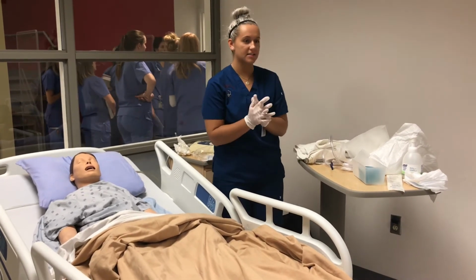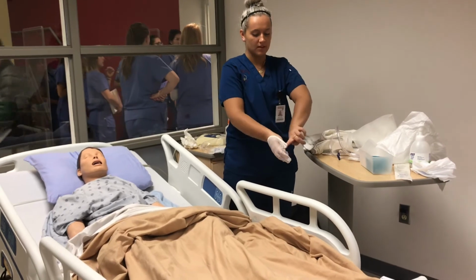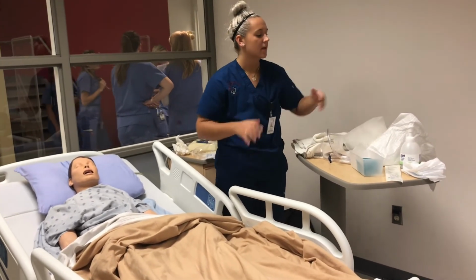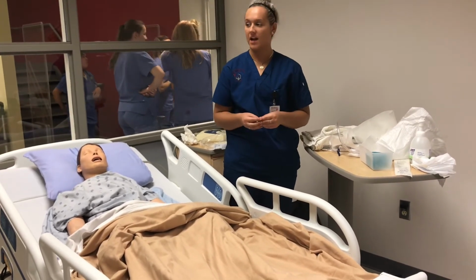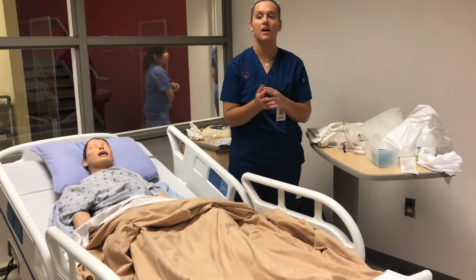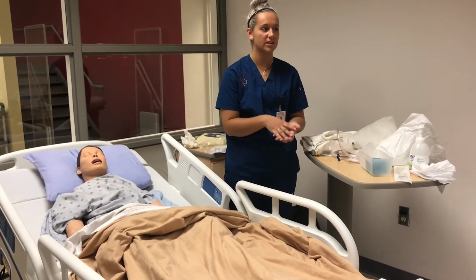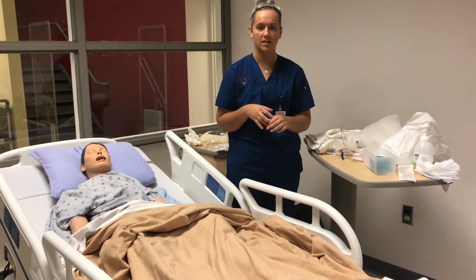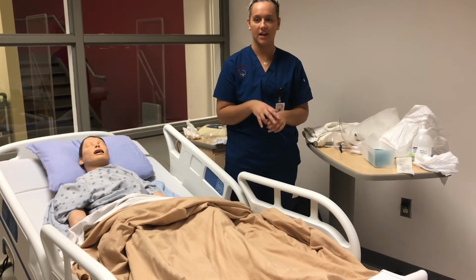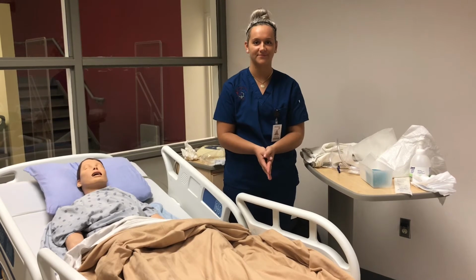And then it's necessary to finally take off your gloves and dispose of them properly. It's important to perform hand hygiene. Instead of using hand sanitizer, it's important to actually wash your hands, as your hands have come into contact with bodily fluid, and hand washing is more effective at getting rid of the bacteria that you've come into contact with.